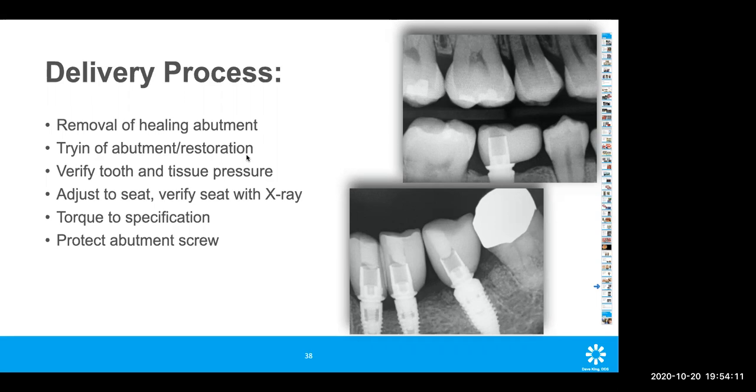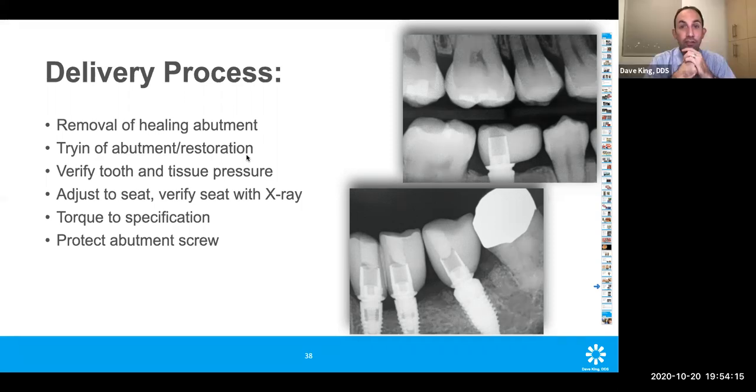Okay. And screw retained or stronger than cement retained? Generally, yes. And the primary reason for that is there's a junction between the cement and another restoration, whereas with screw retained, you've got a block. It's a unified material. However, with today's cementation processes, it may not be that much greater. And I don't know what the testing out there specifically says, but generally the screw retained are much stronger.